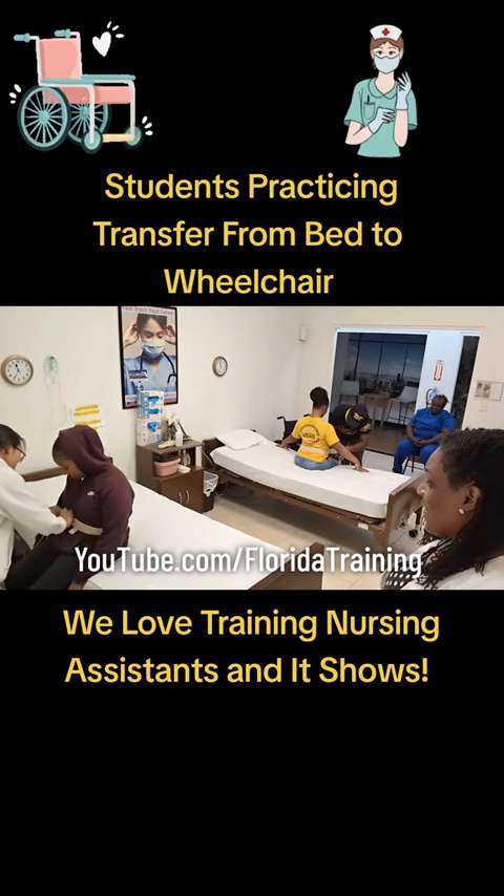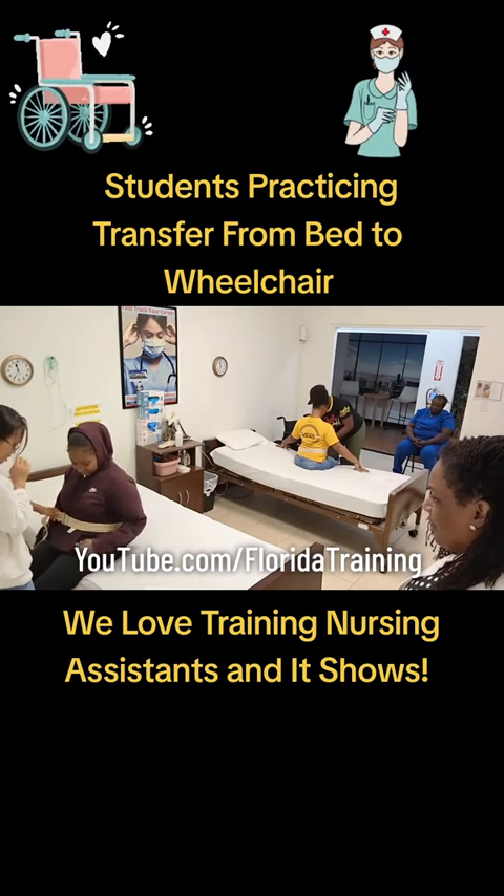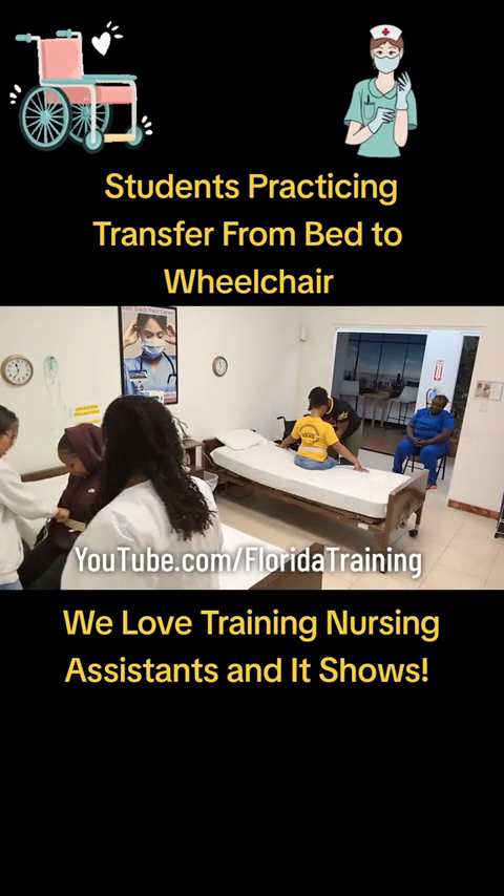Pull it tight. Don't be nice to her — you have to lift her up. Please take your phone out of your pocket because it's going to be a hazard. Thank you. All right, let's get this belt low.